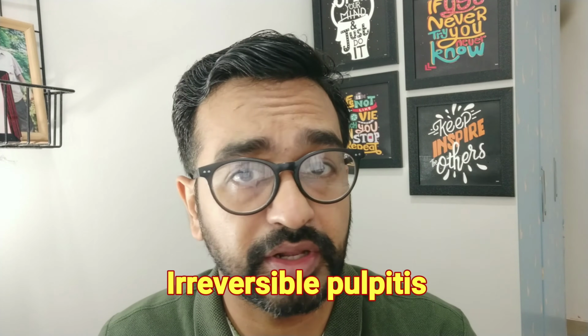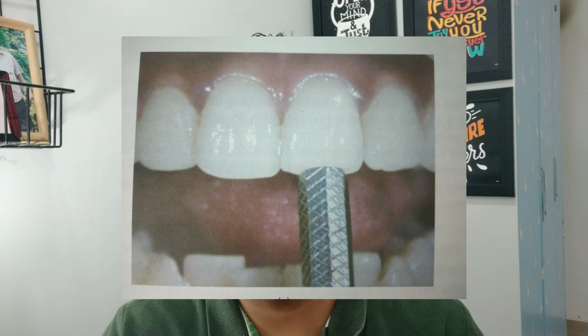Before starting the root canal treatment of any kind of tooth, if you see there is a proximal caries, take a radiograph, and we check the tenderness on percussion test. If the pain is there in that particular tooth, in that tooth only we have to do the root canal treatment. For example, there is a 46 and 47 right molar tooth, and you cannot see the caries occlusally.